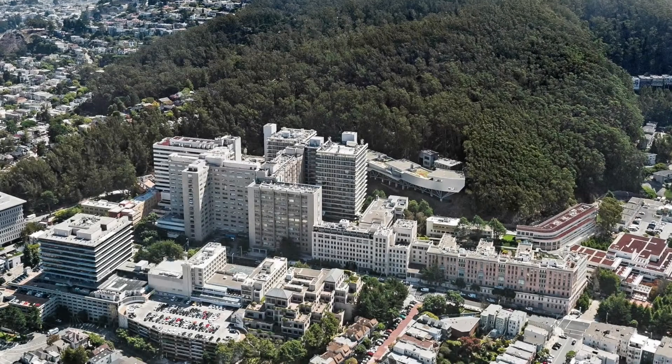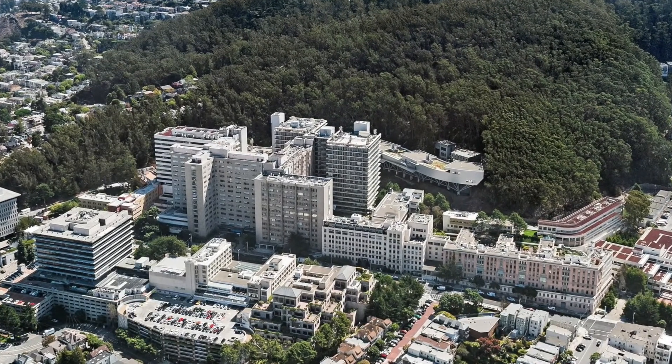Welcome to the UCSF Department of Radiation Oncology. This video is a brief introduction to the SDX breath hold system.